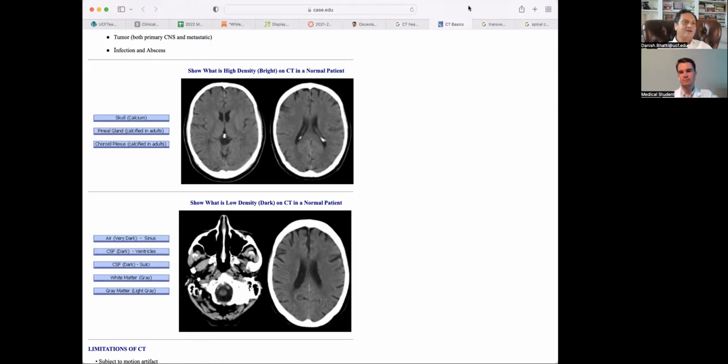Now, there is another concept which is called windowing. Once you have a CT scan, you can ask the computer to make it more bright or less bright. You are now artificially filtering the Hounsfield unit. The natural calculation is the Hounsfield unit, but now you can make it more bright and less bright. Sometimes we call them windows. I don't know why we call them windows.